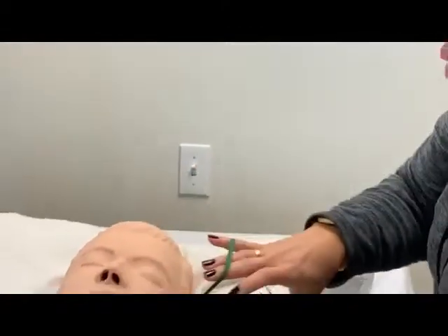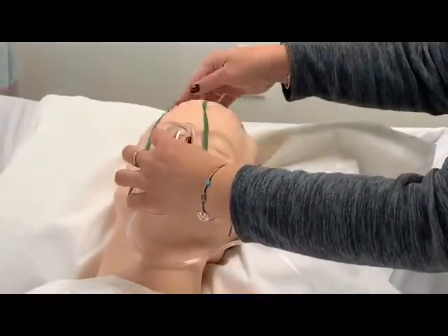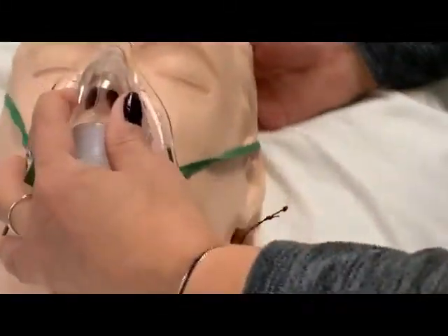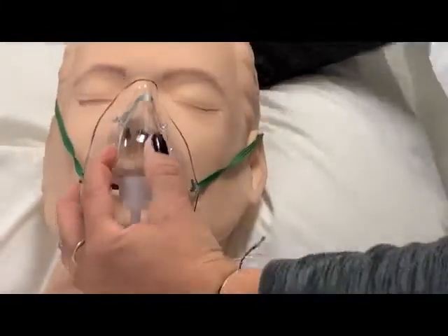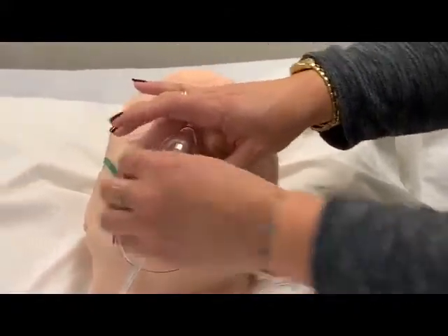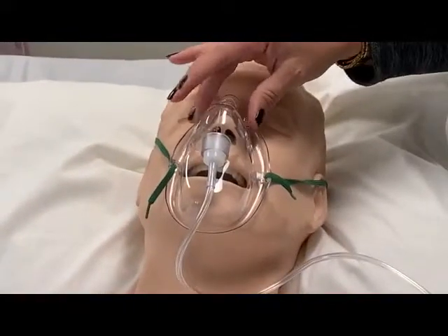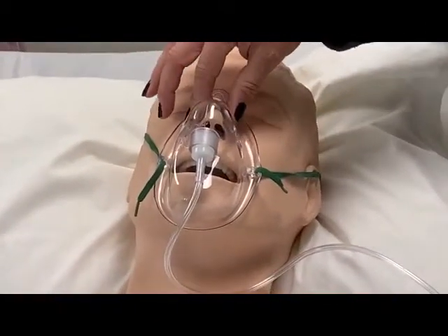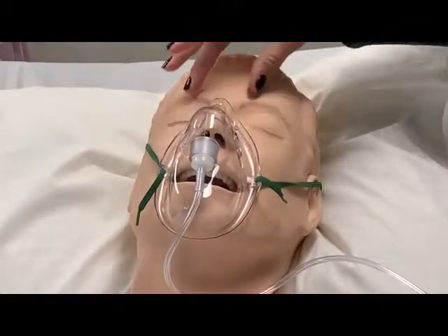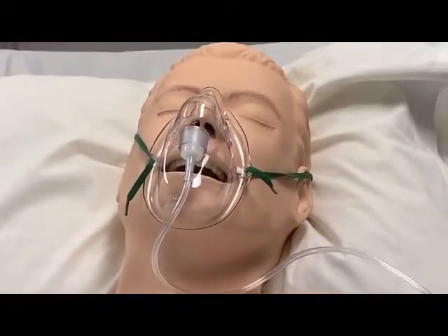I'm going to explain to my patient that I'll be putting a mask on them. It's going to fit over their nose and down over their chin. The strap will go around their head, and then you have the ability to adjust it so that it fits the patient appropriately by pulling on the 2 strings on each side. If you have a smaller patient, you can use this metal clip on the top here to make it a little bit tighter so that there's not so much flow maybe blowing up into their eyes, something you need to be considerate of for your patients.